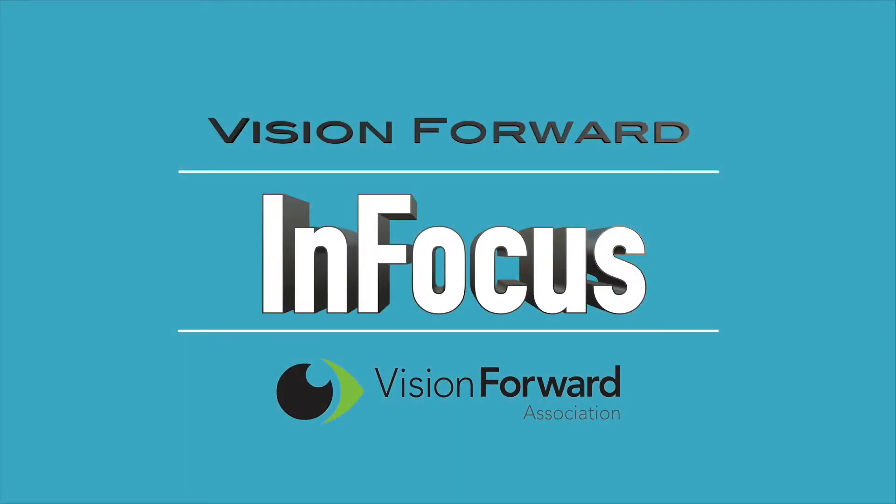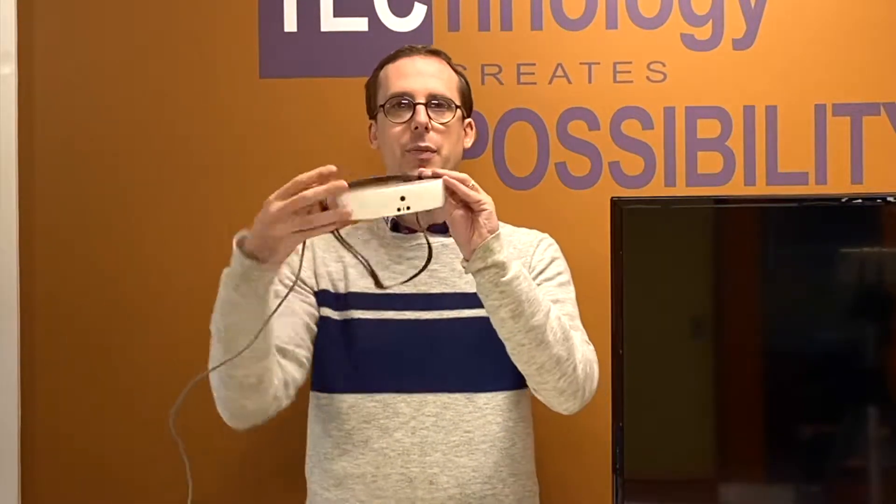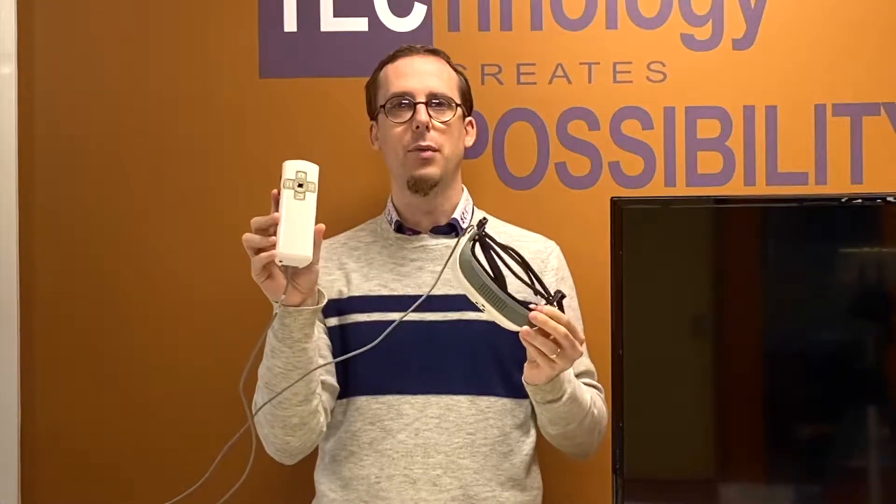VisionForward's InFocus team presents. Hi there, this is Luke Scriven here at VisionForward. Welcome to another tech demo — a demonstration of the eSight 3 electronic glasses. In this week's tech demo we're going to be taking a look at the eSight 3 electronic wearable glasses. These are made by eSight in Canada and they feature a very nicely designed headset which is slim, lightweight and attractive, connected to a control panel by a wire. So let's jump in and take a look at some of the features.